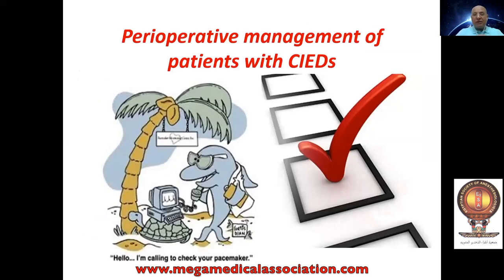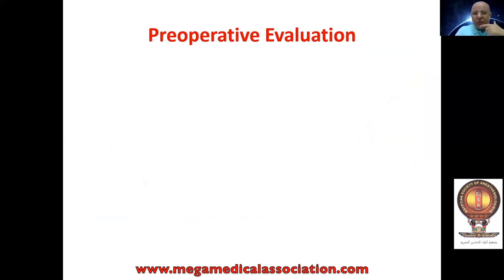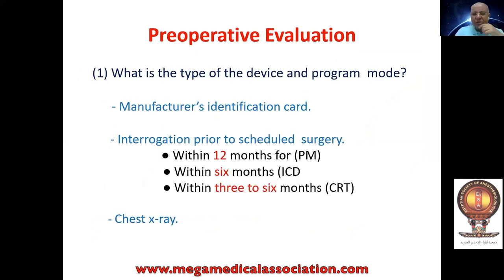Now to come to our main issue, the perioperative management of patients with CIED. What to do? A practice advisory from the Heart Rhythm Society and the ASA in 2011 made a very good consensus about that, and it is renewed more and more. You have to ask the patient; there are four questions you have to find the answer to before you start with your patient. Number one, what is the type of the device and what is the programmed mode? You have to know the type of the device, either from the patient himself, who may come with their card, or from the manufacturer card, or you contact his cardiologist.